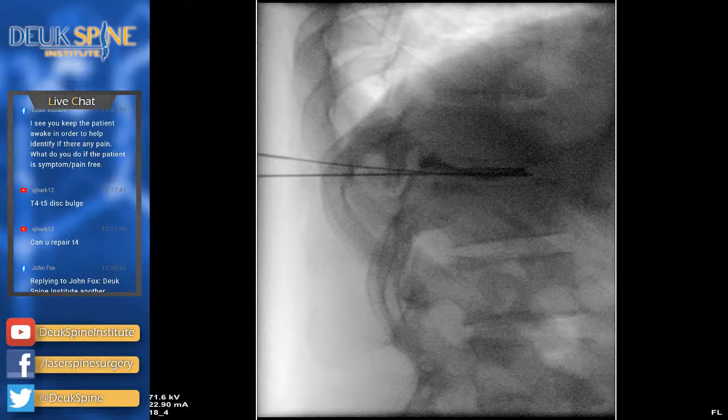All right, so here's the most incredible thing. We're doing the whole surgery through a 4-millimeter cut. Do you understand what that means? A four millimeter incision. It's remarkable. To fix this disc endoscopically with a 4-millimeter incision.